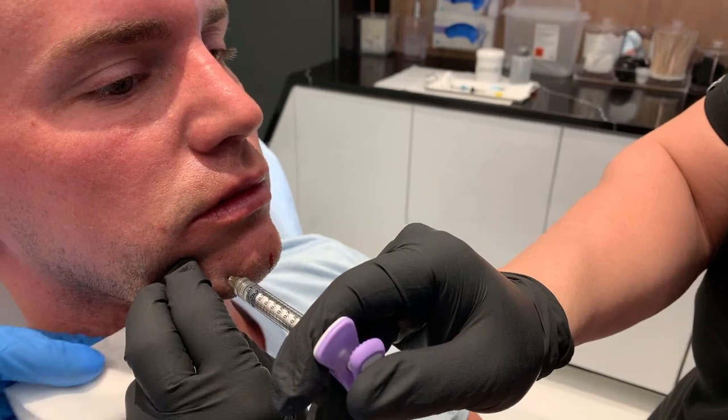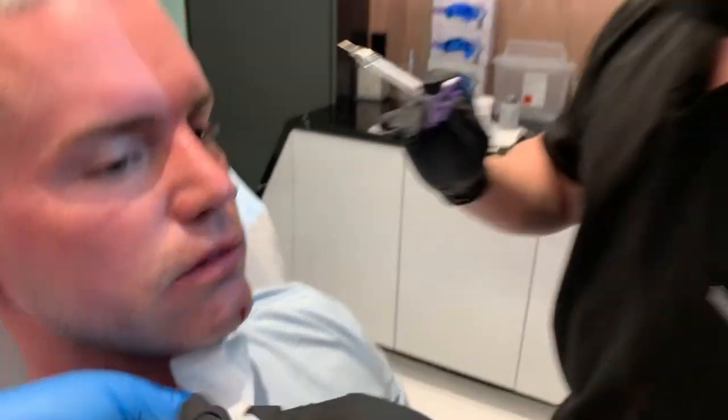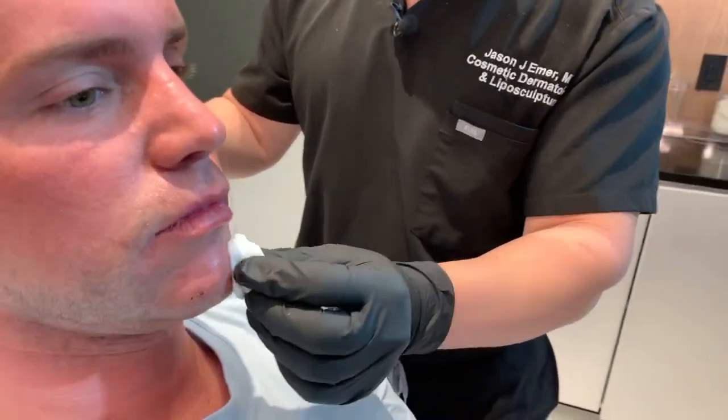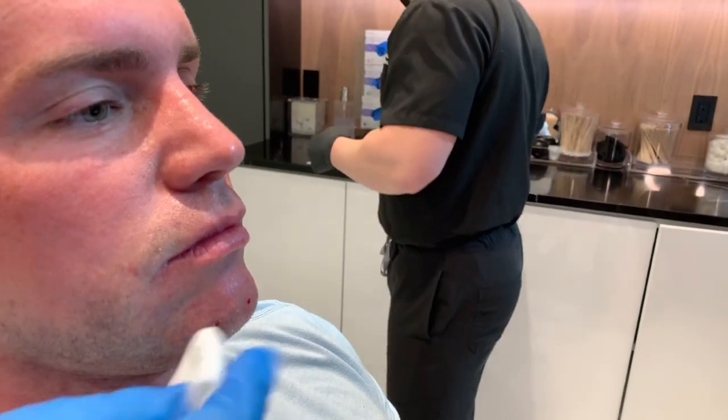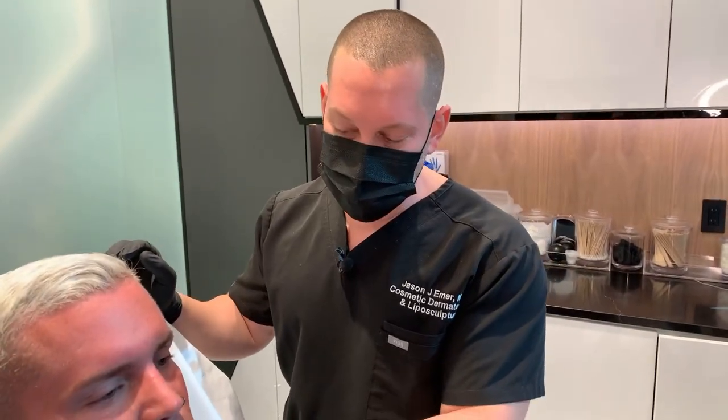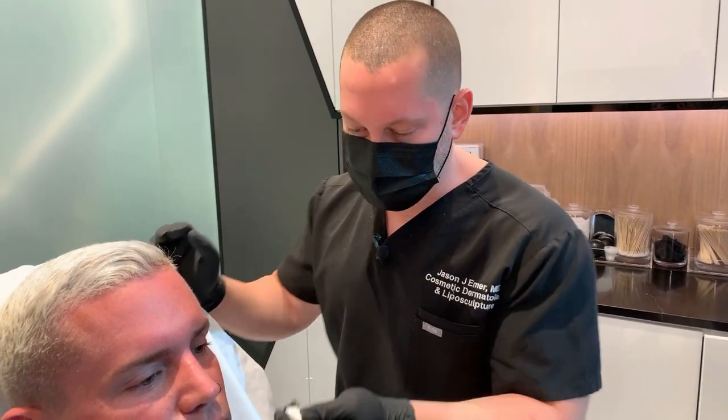They want to know, do you use the same filler for the lip and the chin? Well, guess what, guys? Today we're not. That's the Ultra Plus, and actually you can see right away a little more width and a little more projection. Ultra Plus is unique because it has the ability to hold more water, which I don't necessarily like in the lip. You don't want the lip to get too swollen, so now we have that projection.